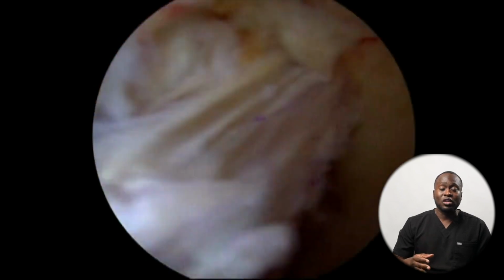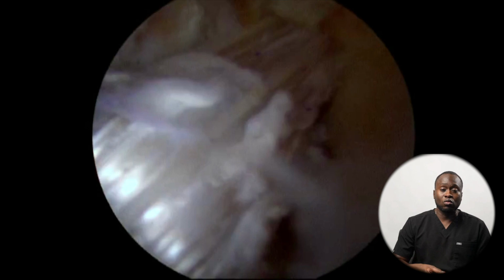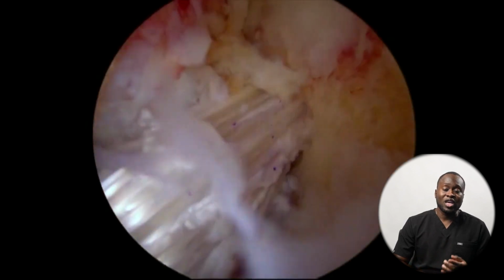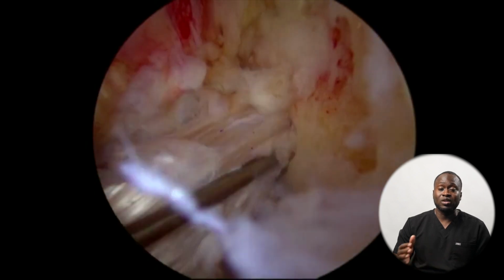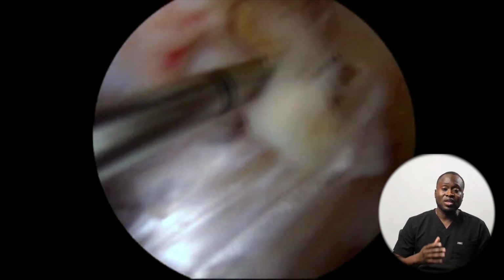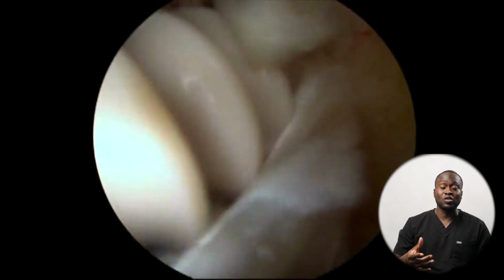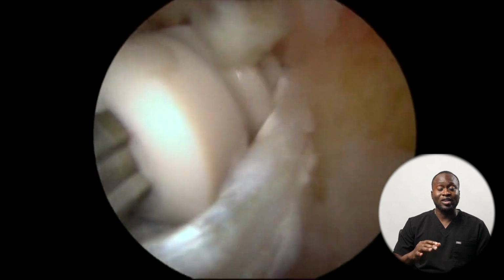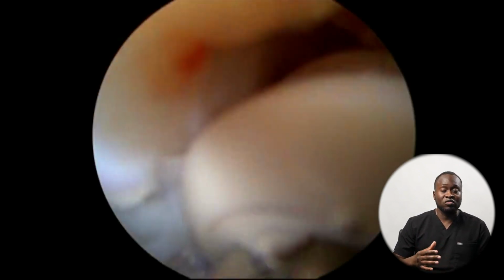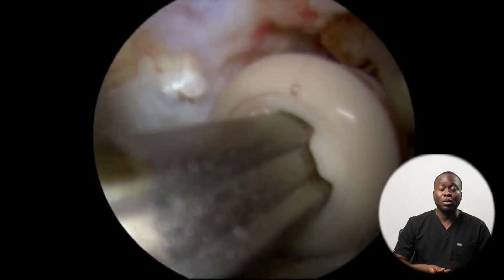Once we have that in place, what we can do is take screws, plastic screws in my case, it varies by which surgeon's doing it, and we actually put those screws in to hold the graft on both sides, both the femur and on the tibia. And that holds it in place. Now those screws are not gonna hold forever. The idea is that the body will heal those areas in place. So the screws are just there for protection until that can happen. And that process can take anywhere from 6 to 12 weeks. So we wanna be careful during that time period that things heal properly.